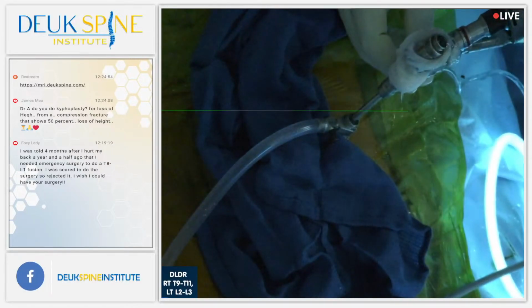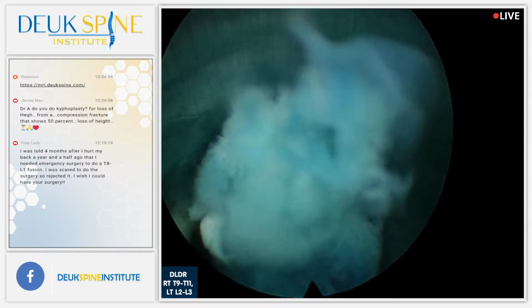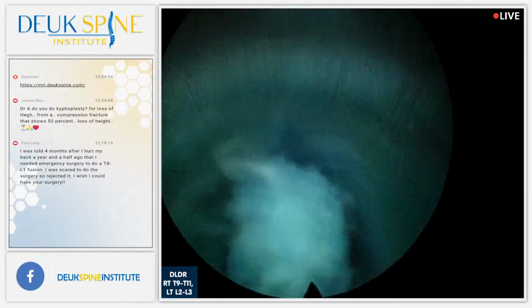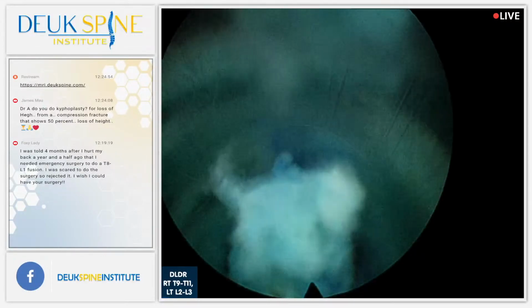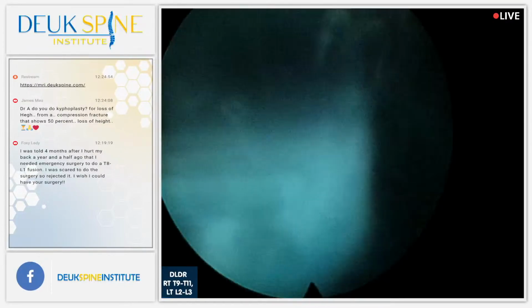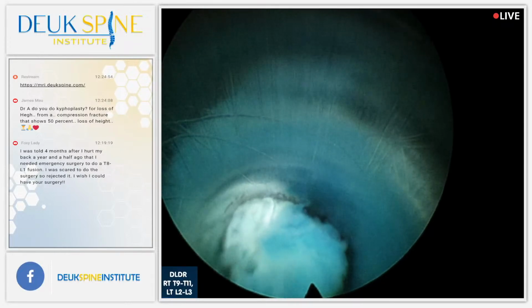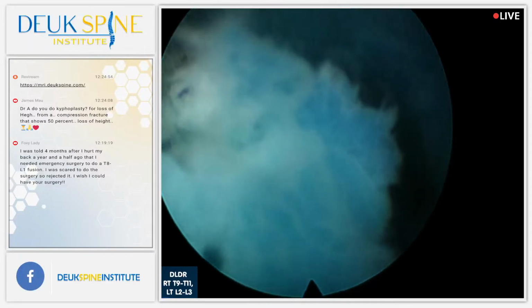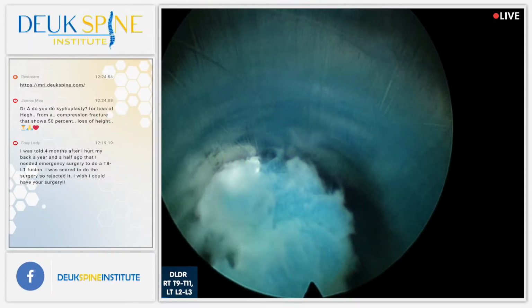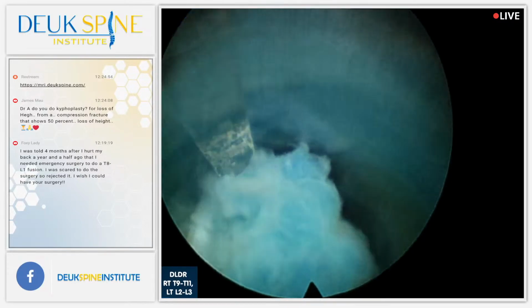Oh yeah, look at that. Degenerated nucleus. Fascinating. Remember, this was a 9.5, right, out of 10? This is all herniated disc. Degenerated, herniated. Inflammation is destroying it. Look how smooth that surface is on that piece. That's the work of inflammation. That's about 6 months worth of inflammation right there. And that's how old he said this herniation is.